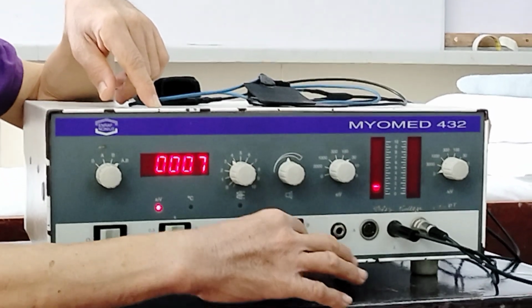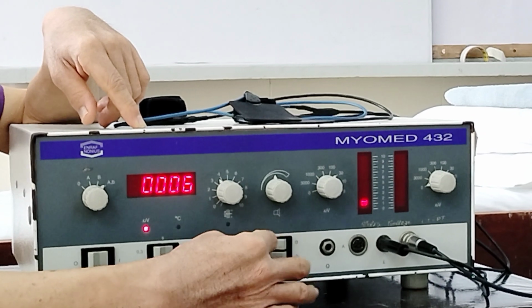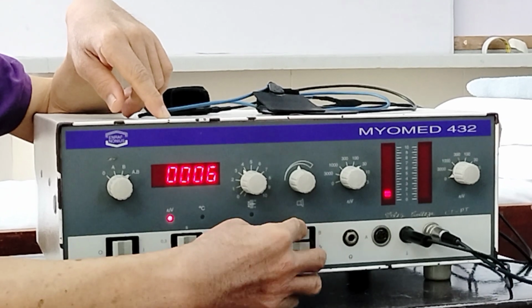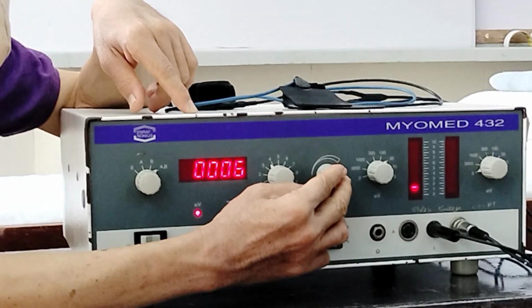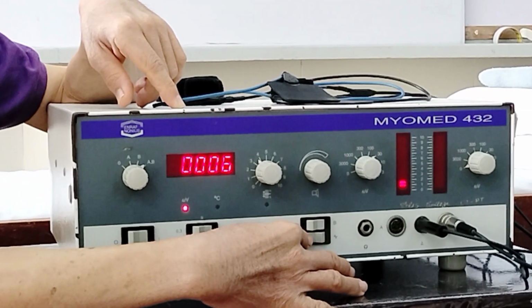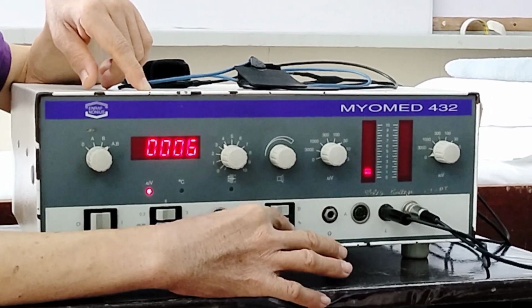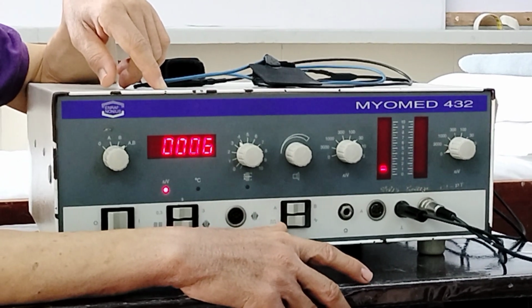Below here is a selector switch for which channel's audio signal you want to produce, either channel A or channel B. It can't be both. Okay? Further below, this is used to select the type of audio signal that you want the patient to hear. This one is the rectified signal.